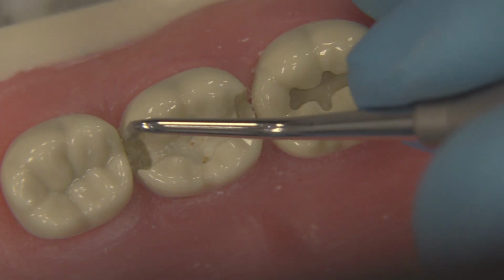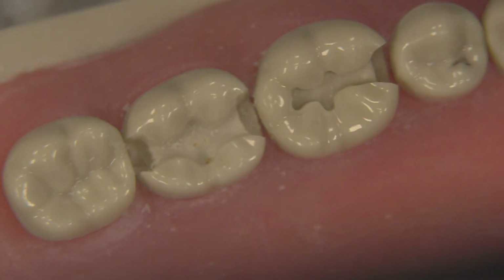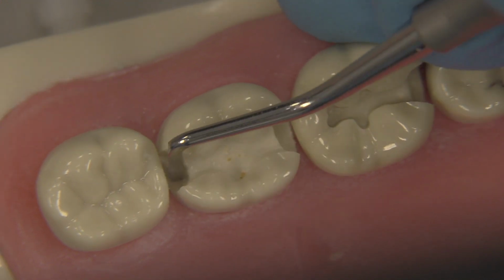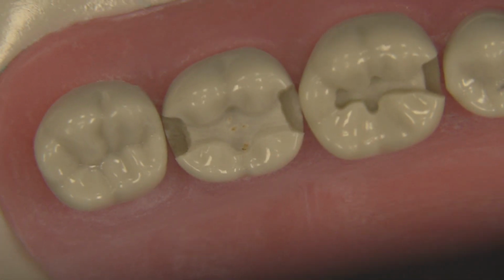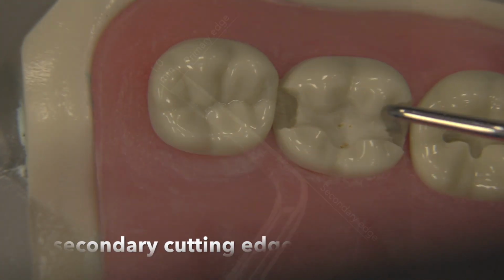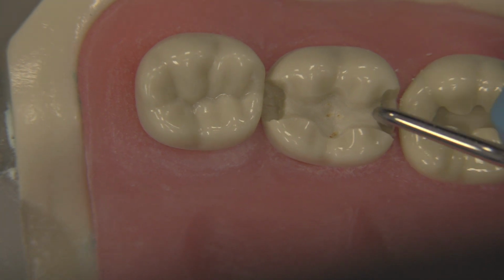And folks, which way is the bevel facing on the instrument? Towards the side of it. Right, towards me, right? And here it's away from me. So get a little bit of an inlay going. It doesn't have to be flawless at this point. Just get something started. Secondary cutting edge is kind of helpful to even out the axial walls.